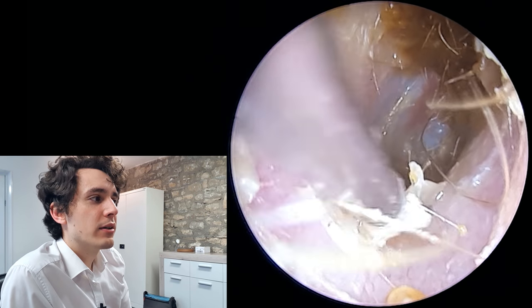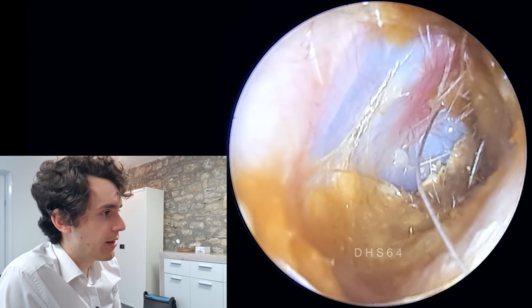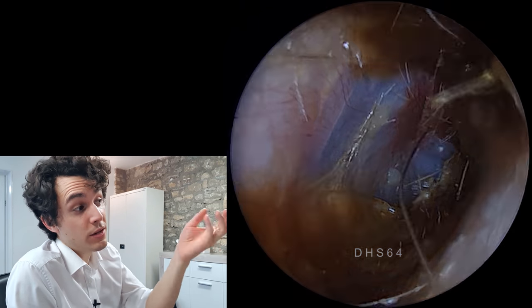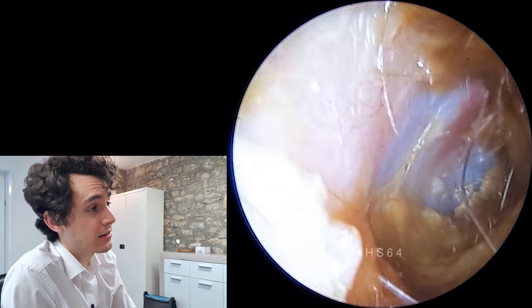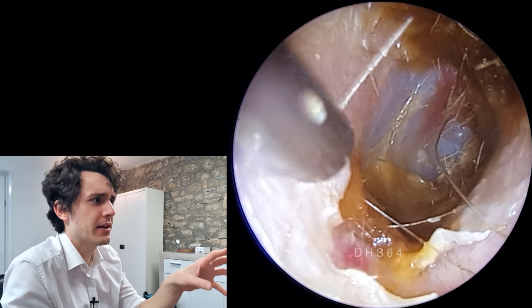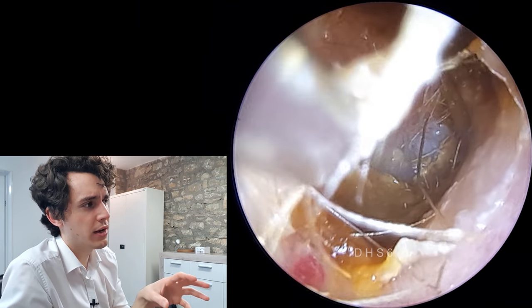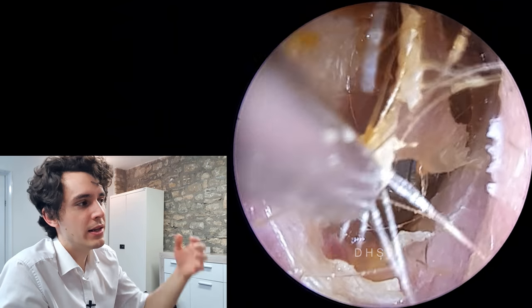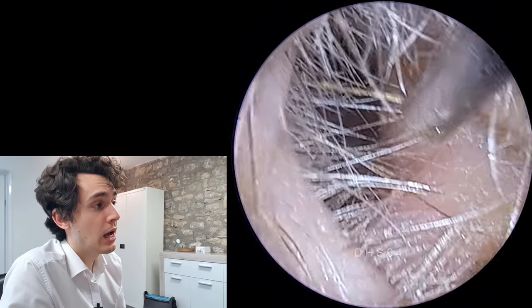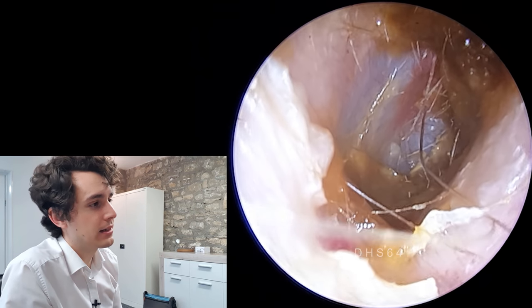We've got more of the eardrum clean here, and we've just got some dead skin lying in the ear canal. It's not quite as exposed as I'd like — there's gray skin in the background and it's pinkish around the handle of the malleus. So that is the eardrum back there, and it's kind of caped. I rather suspect this patient has probably used sodium bicarb or hydrogen peroxide for a short time, the earwax liquefied and slid right down against the eardrum, and then the patient gave up and it's kind of reformed and recaked.